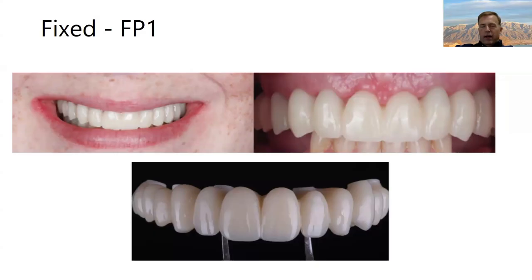and then you can deliver that. The other thing, and you kind of see it with this case, is the implants have to be perfect. They have to be placed just like they would for a crown and bridge case. And they don't really need to be placed where the teeth are now unless they're ideal. They need to be placed where the teeth are going to be.